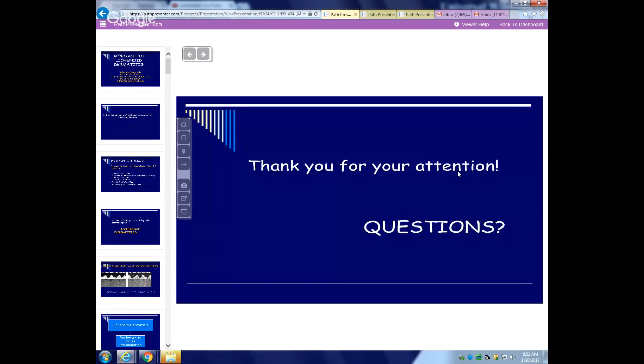Yeah, this is really cool actually to integrate a digital slide into a PowerPoint. Yeah, and it's very easy. It just takes a minute to integrate the whole thing, and then move the slides around and make the presentation actually. And it makes the presentation much more interactive, and you can see a real slide. And we can use it for tumor boards, right? If we can scan our slides, you don't have to take 100 pictures. Yeah. We just need a scanner.